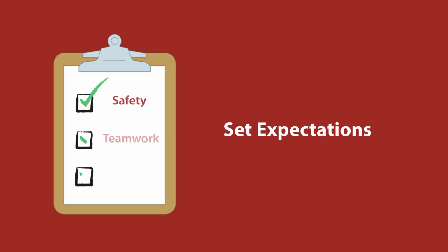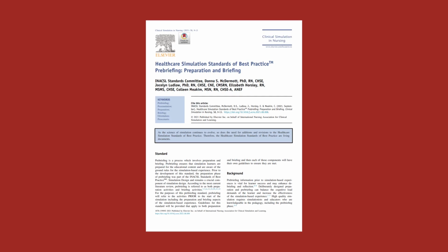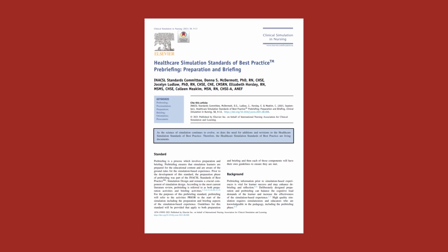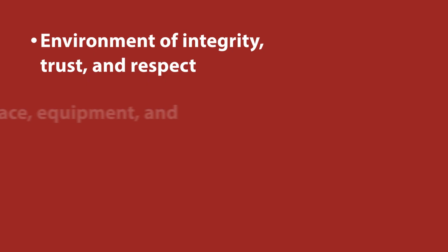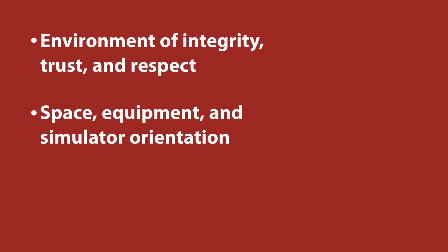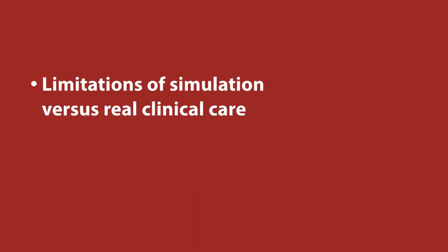Before each simulation, set expectations for safety, teamwork, and respect. A pre-briefing is one of the published standards in the Healthcare Simulation Standards of Best Practice, encouraging the review of a number of elements of the simulation-based experience with your learners, such as an environment of integrity, trust, and respect, space, equipment, and simulator orientation, purpose, objectives, and time limitations, limitations of simulation versus real clinical care, and evaluation methods.